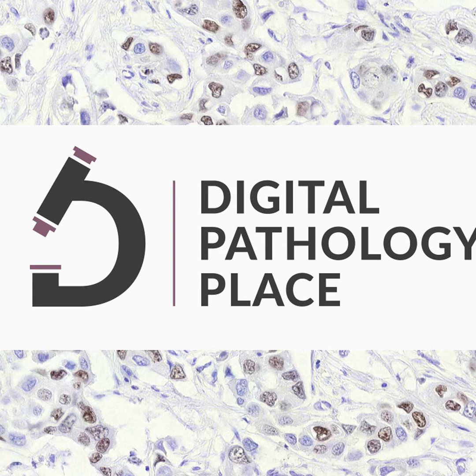Interestingly, several of the scanner components are identical to those found in a microscope, highlighting the reliance of digital pathology on light microscopy. It means that the whole slide scanner is a microscope with an additional capability to produce digital images. And the technology used to produce these high-resolution, high-magnification digital images is light microscopy, the same technology that was used by Antoine Leeuwenhoek to look at protists and bacteria in 1677.